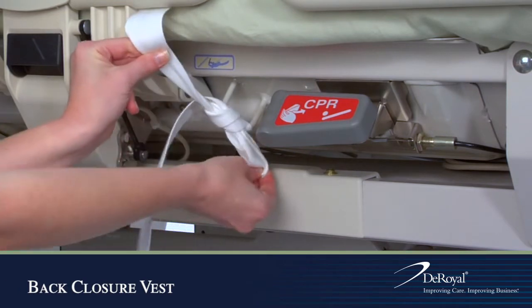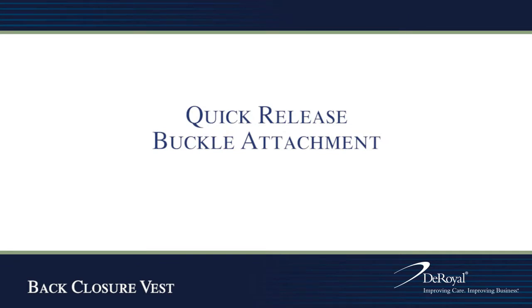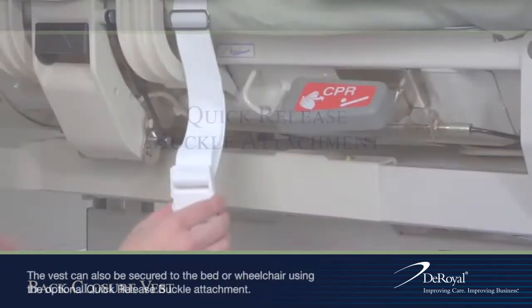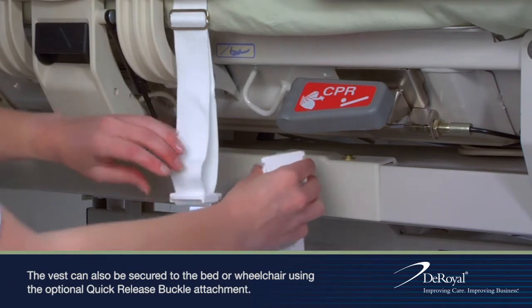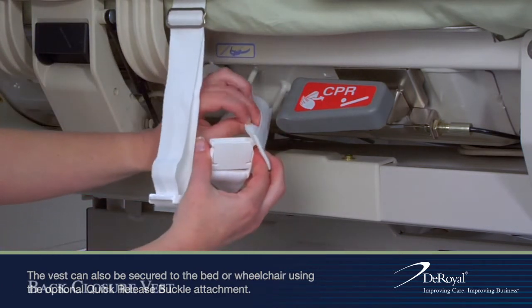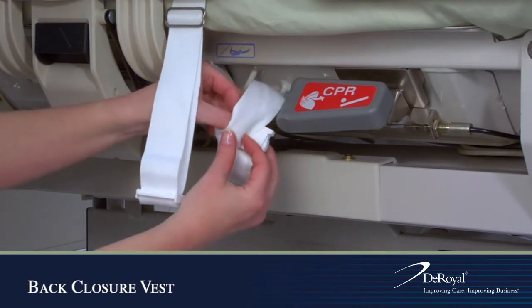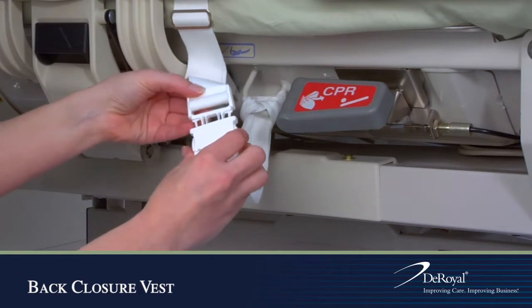Secure excess strap out of the patient's reach. Release the female end of the buckle and wrap its strap around the bed frame. Pull the female portion through the loop and connect the male and female ends of the buckle.